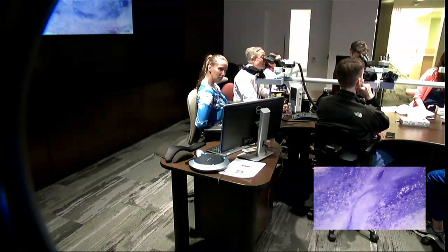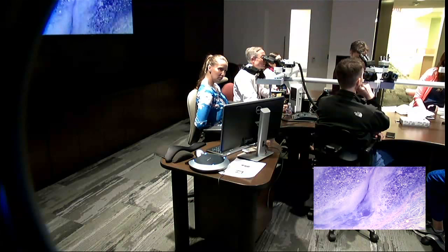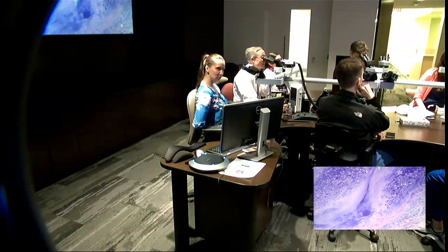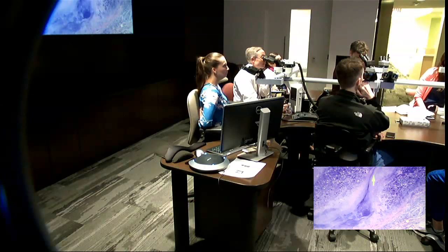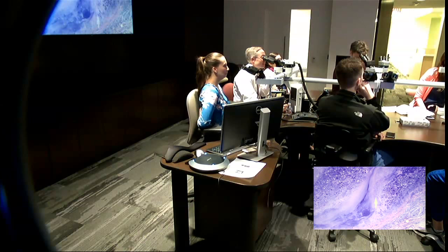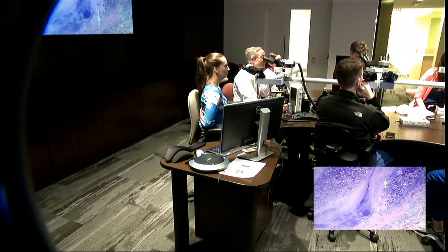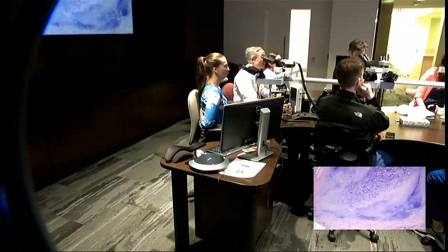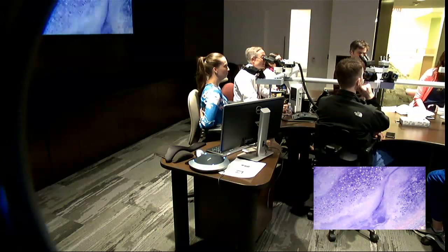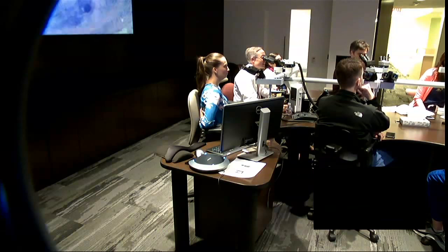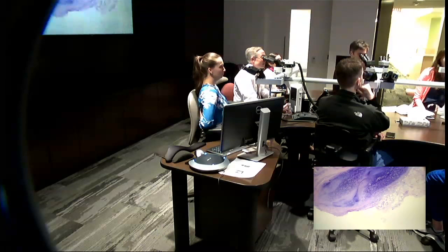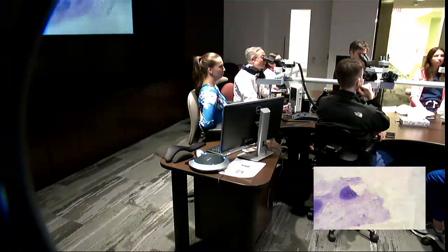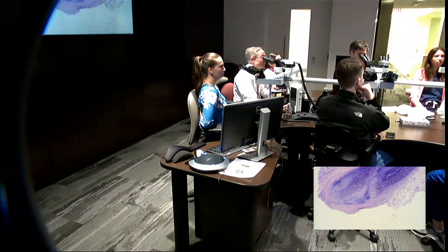This isn't chondrodermatitis either — that usually gives you degeneration of the cartilage centrally, not this. So what else can do this? It's a pseudocyst of the auricle, which is a manifestation of trauma to the cartilage.